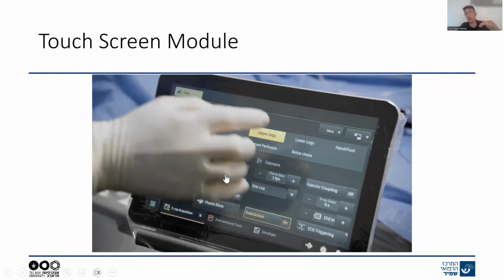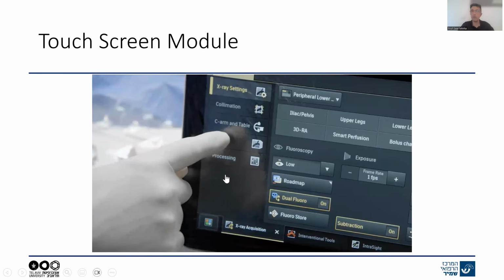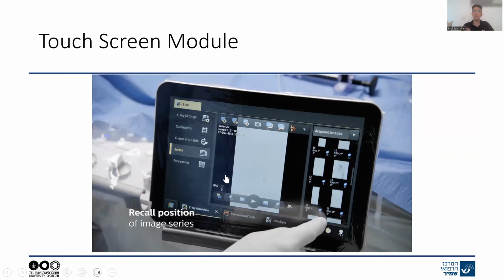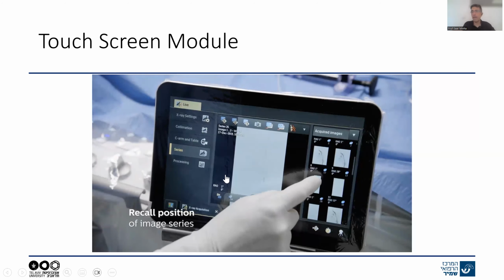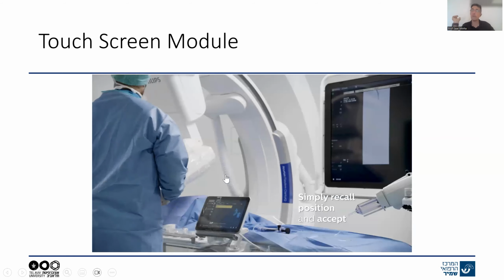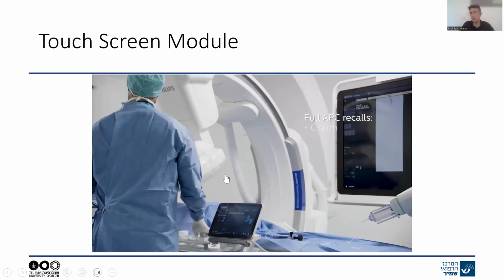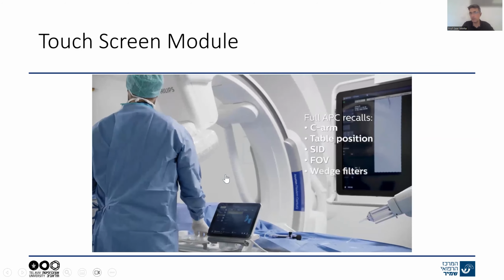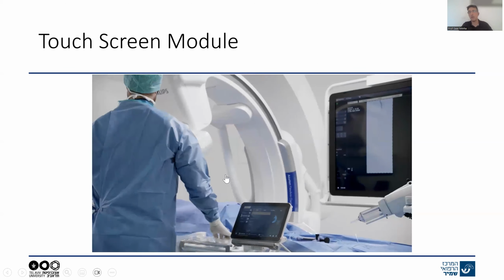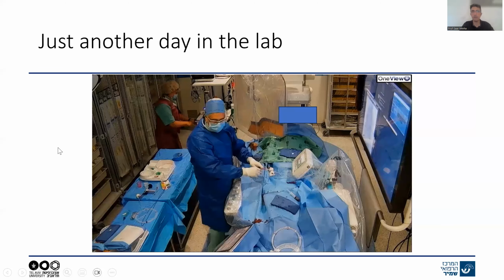streamlined through the procedure, and it really gives you the ability to do things by yourself. Then your staff can do something else and keep the patient safe. Before we had that, everything that this operator touches, I needed to ask my technologist to do. Now I can do everything from my end. You see that the operator here is using this V button to go from one projection to the other, and this is how he moves the patient with the floating table.